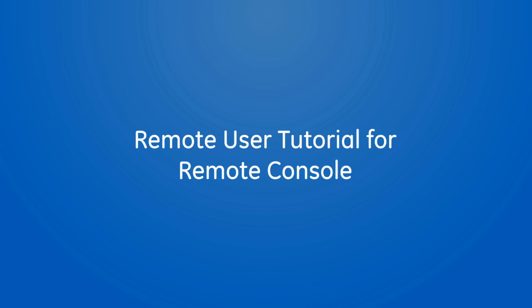GE Healthcare's Remote Console allows customers to remotely connect to GE imaging devices for guidance and training purposes. The remote user will connect to the imaging devices through a web browser. Once connected, they're able to view the scanner console or even control the mouse and keyboard. This video is a tutorial for remote users to describe how to connect to an imaging device and an overview of the Remote Console application.